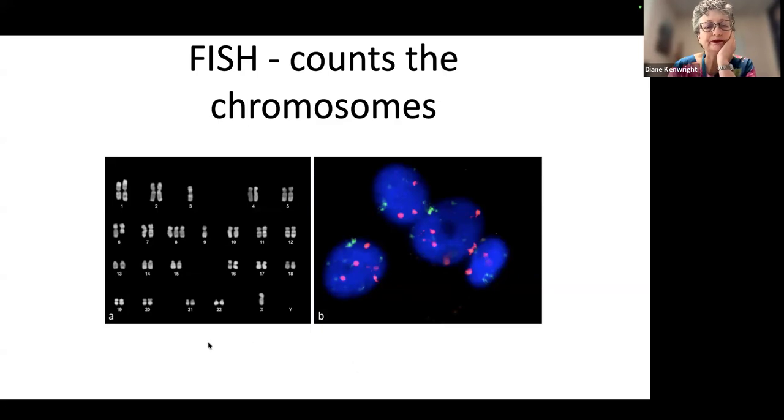Let's have a look here. Oh, yep. Maybe I got this one mixed up. All right, just ignore what I said here. So this one here, 3 is labeled. Oh no, that's right. Sorry, 3 is labeled with green and 8 is labeled with red. So we've got lots more 8 and not much green.